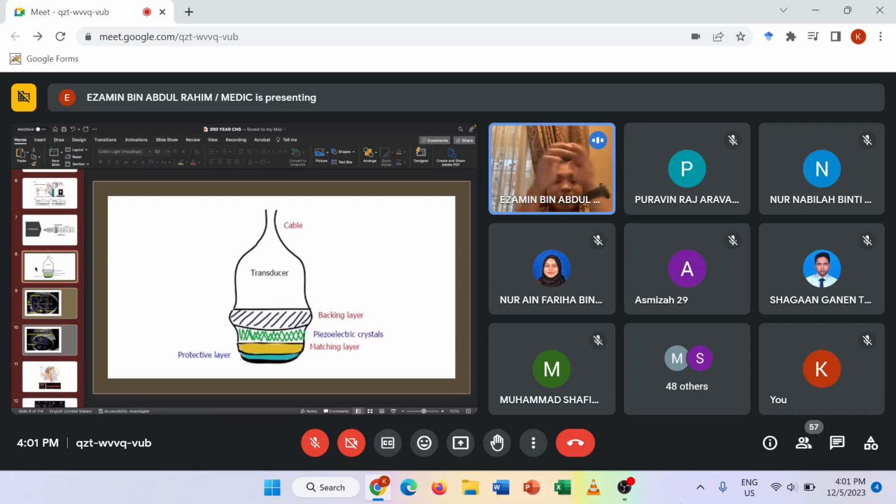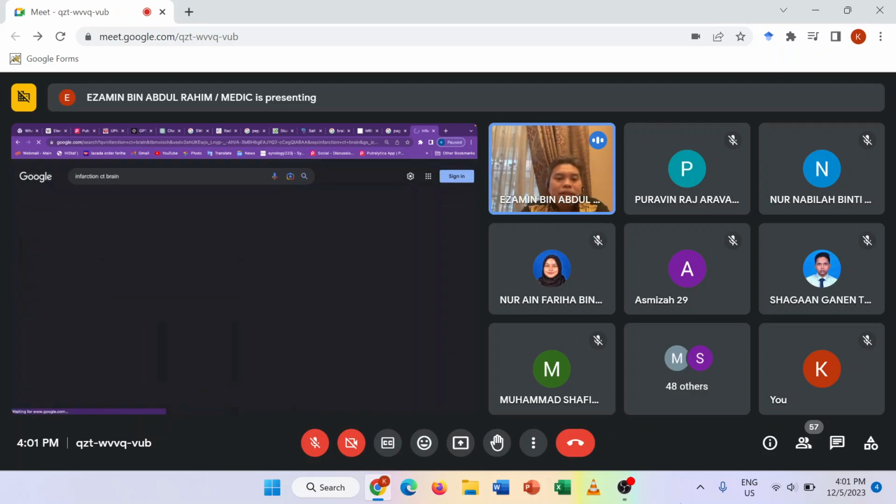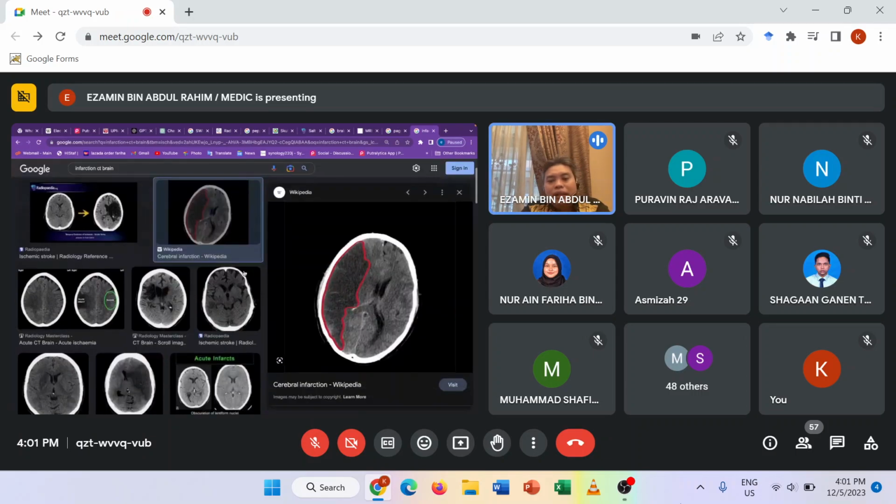And then let's say infarct. Infarction on CT brain is just hypodense. Okay. This one is older, this is cytotoxic edema. The whole M1, the whole MCA territory, and the ACA and the posterior cerebral artery, PCA, this is ACA, okay.